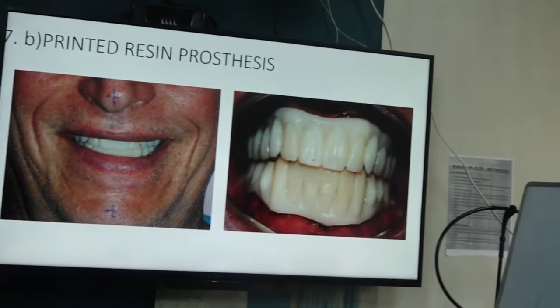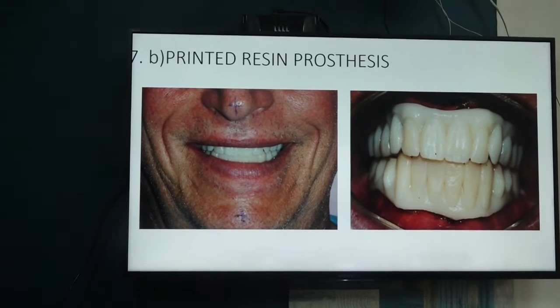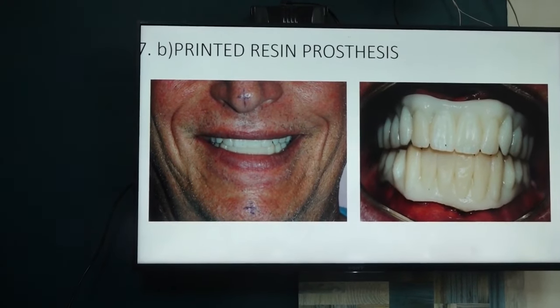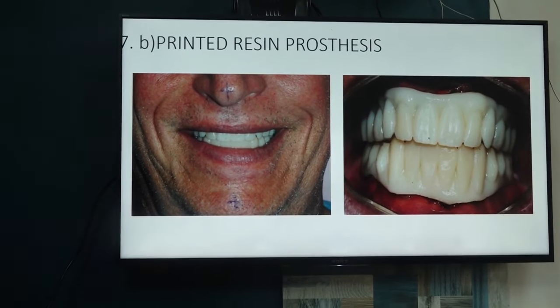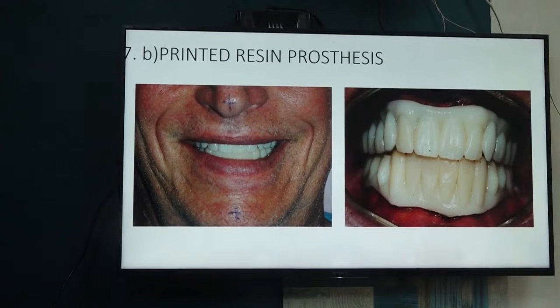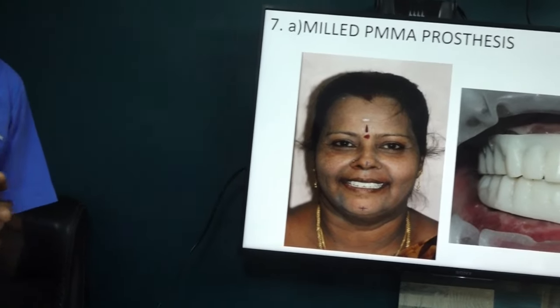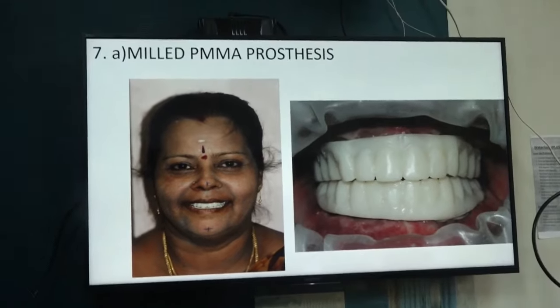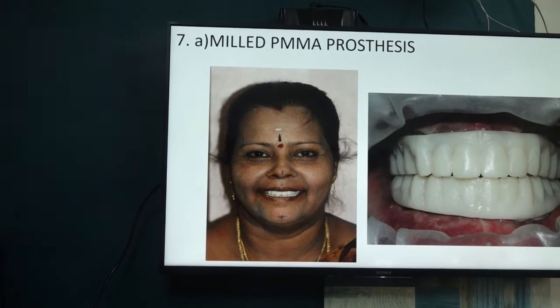So 3D printing, this is the process, right? So the process has two types, one is milling and another printing. Okay, printing we have used rarely. Maybe from next week we will be using more of printed processes. See, there are only two technologies in making the prosthesis construction. One is additive technology, another one is subtractive technology. Additive is 3D printing. It adds and it builds the teeth. But milling removes, it is subtractive.